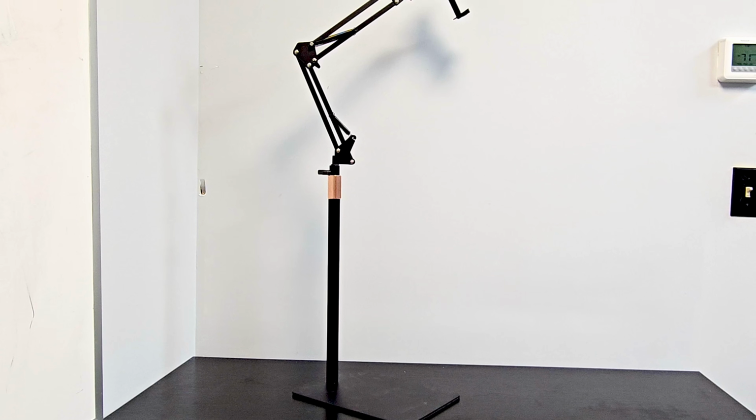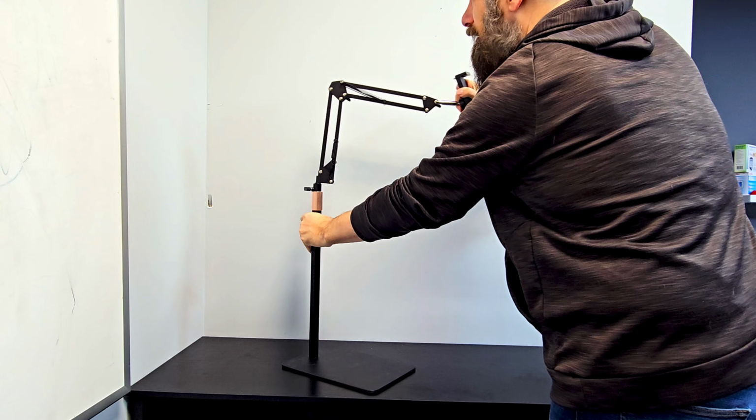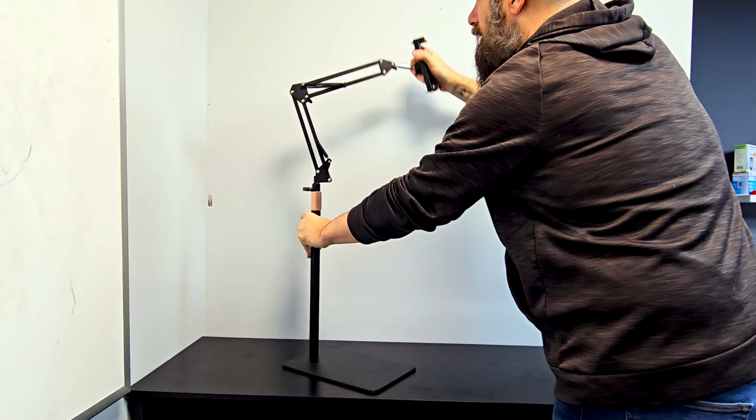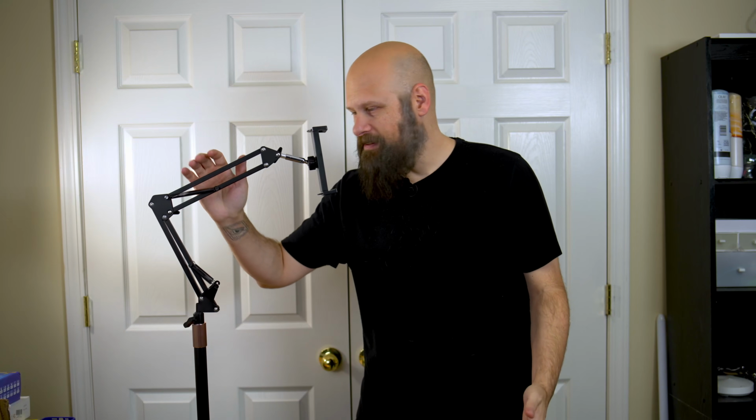And recently, I saw one of these guys on Amazon. This is just a tablet holder that is designed to sit on the floor and even designed to kind of slide underneath the legs of a couch, the legs of a chair. And the best part is these are not expensive. I think I got this thing for like 30 bucks on Amazon.